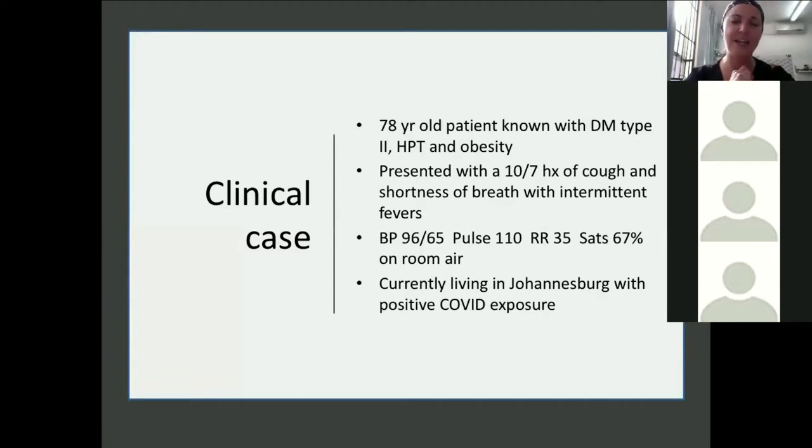And a little bit tachycardic, pulse 110. Respiratory rate, 35. So I'm really worried about that. That's a high respiratory rate. And look at the SATs. 67% on room air. So this is a problem. And let's say it's right now in the middle of Joburg where everyone's got COVID.